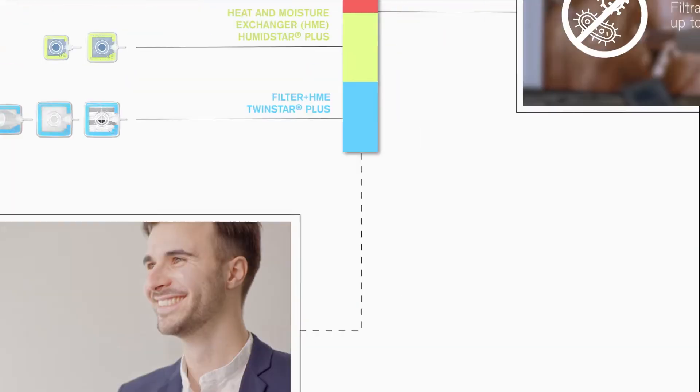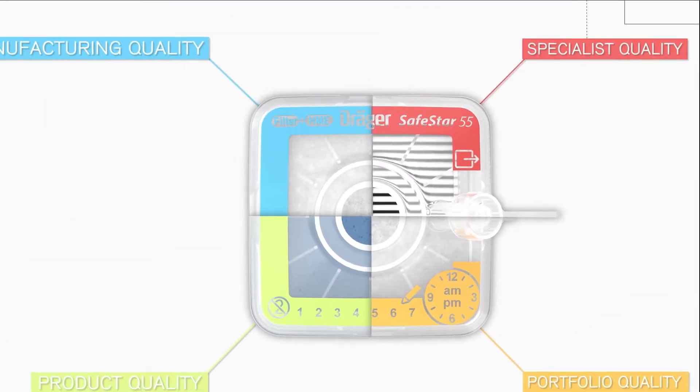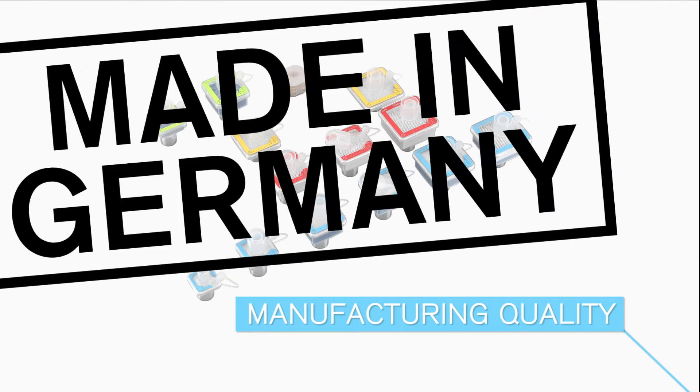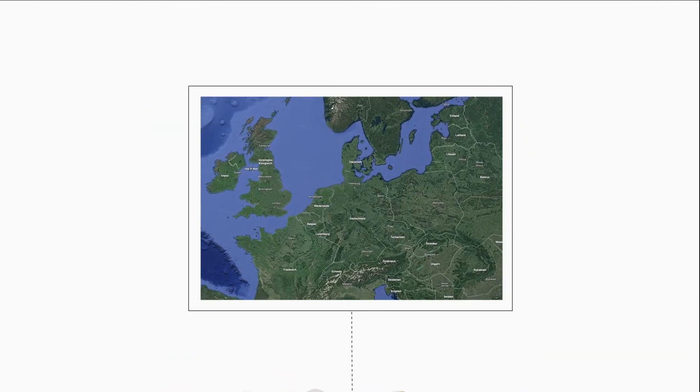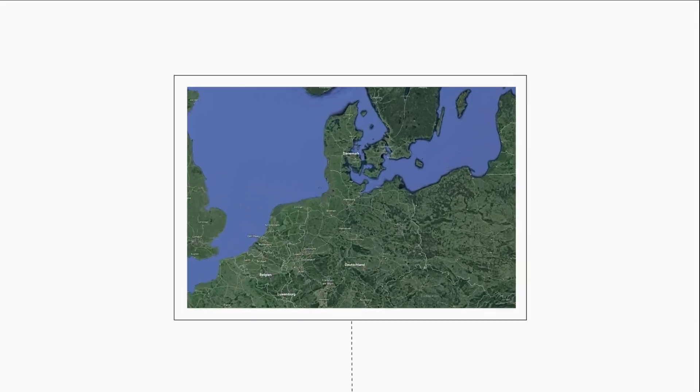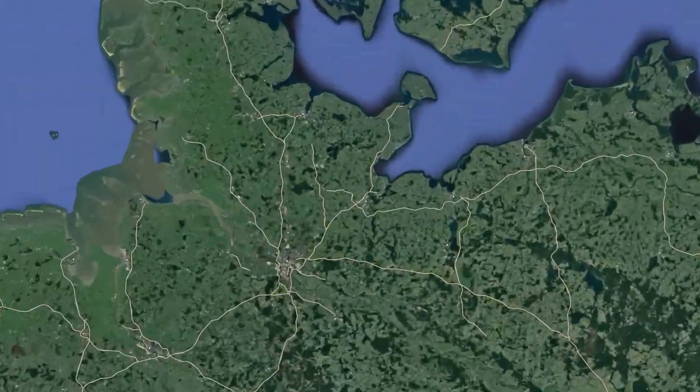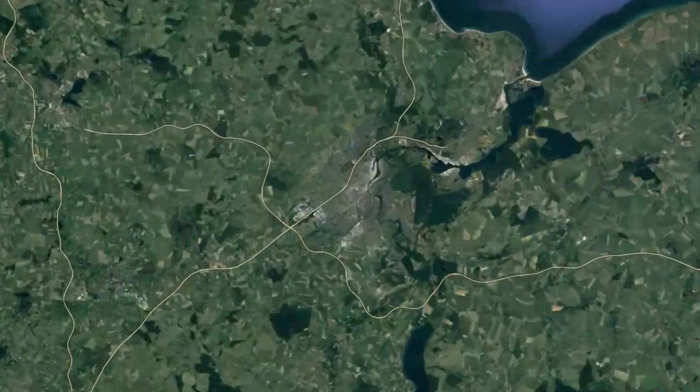After all, our customers are the ones who know what's needed. High-quality filters also require high-quality production. That's why we've invested in developing our production.